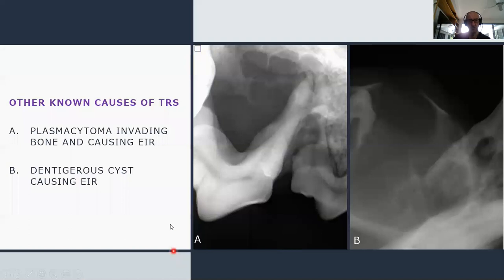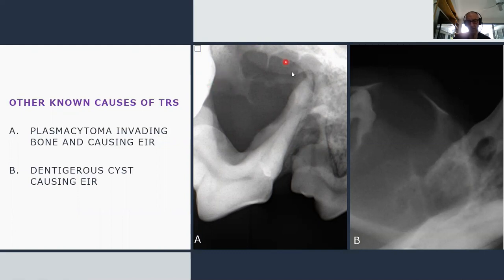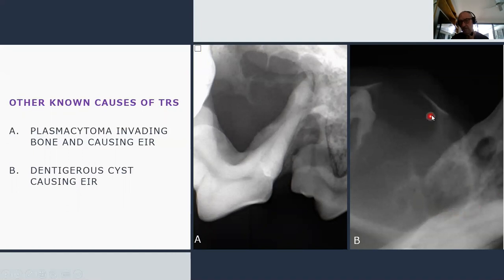Other known causes include plasmacytoma — this radiograph shows significant inflammatory resorption and lysis in the bone around tooth 108. A dentigerous cyst is another cause: radiograph B shows resorption of a canine tooth and premolar 1, with the cystic lesion also resorbing the mesial root of tooth 406.